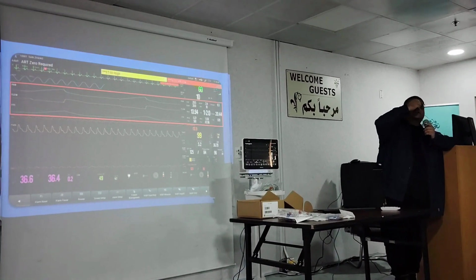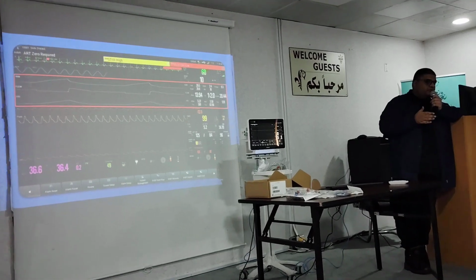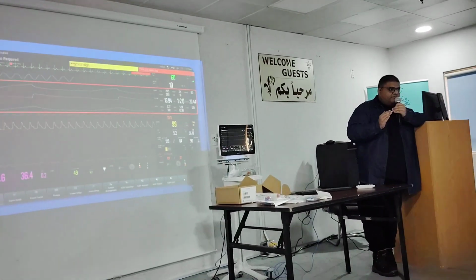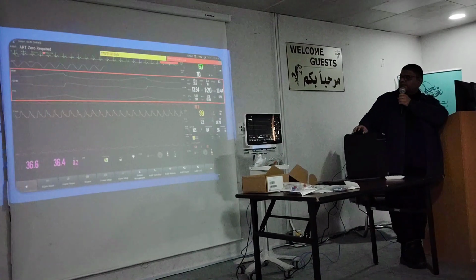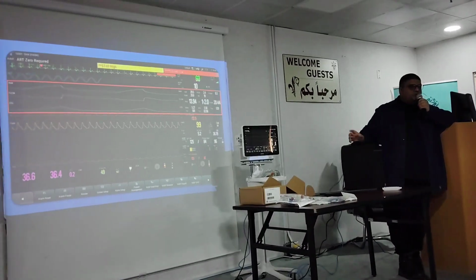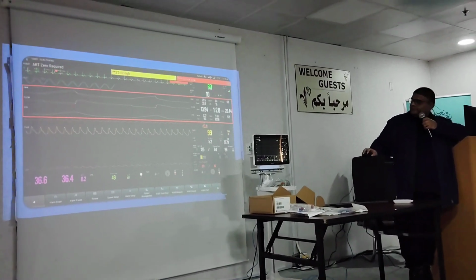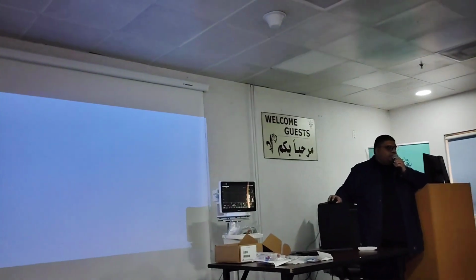So it connects next to the patient. So you're further away from the ventilator and closer to the patient. That means you have less dead space to worry about. So you can have a very long pipe to the ventilator, but your readings will not be affected. This is to ensure a safe ventilator administration.